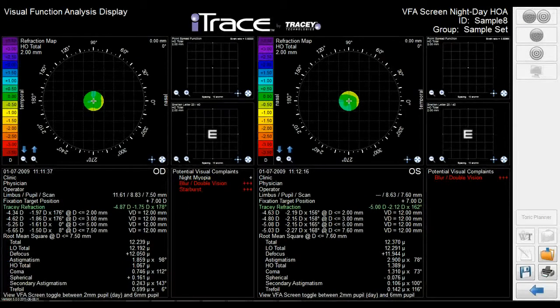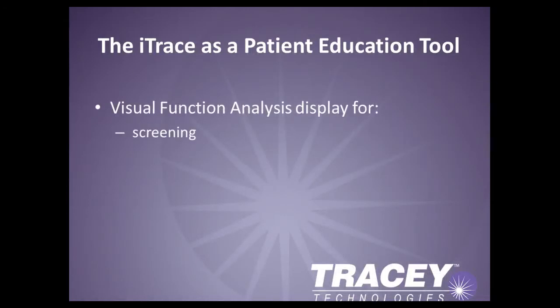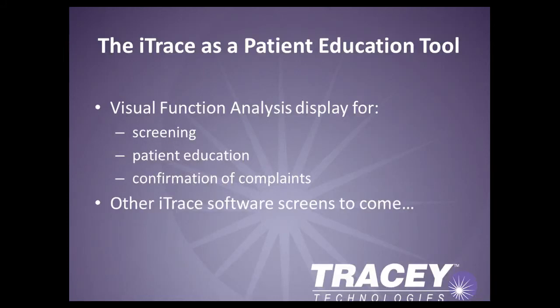The iTrace Visual Function Analysis display provides a powerful patient education tool that shows the patient the best vision they can achieve with lower order correction. And in night myopia cases such as this, you can have a conversation with the patient using this screen to illustrate that with a secondary spectacle prescription, their night vision problems could be readily solved. The Visual Function Analysis display provides a great screening tool for analyzing the patient's vision and determining if additional iTrace analysis or other diagnostic tests may be necessary. We review another powerful screening display available with the iTrace — the wavefront corneal topography summary display — in another webcast edition.